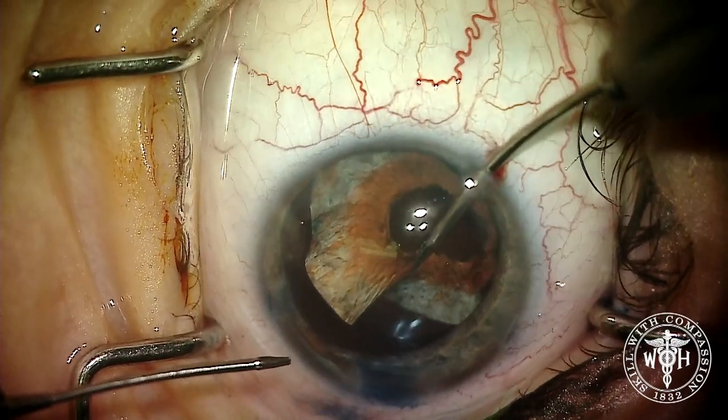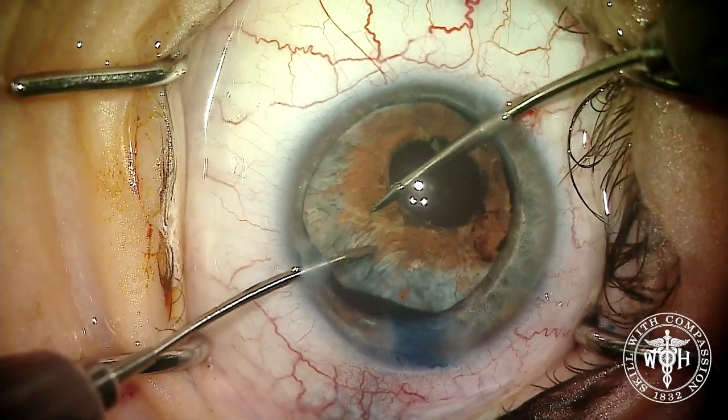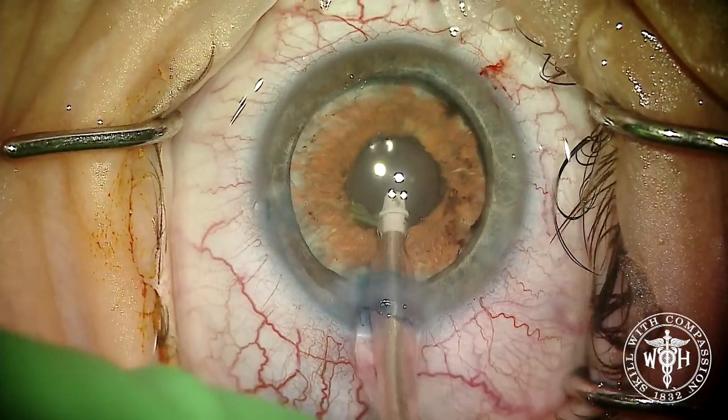You usually have to grab the pupillary border and then twist a little bit to shorten the cord length of the artificial iris. It's a pull and a twist, tucking that iris into the capsular bag. Once the iris is in place, we can finally get the viscoelastic out of the eye.